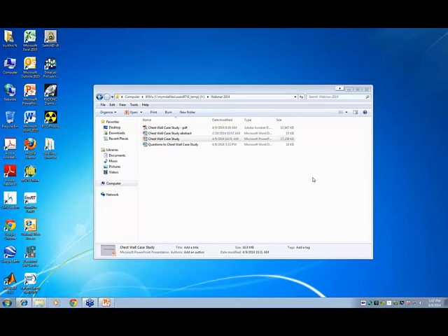The only one that we rule out is the angle between the lateral electron field and the central electron field. That one, we don't want too much gap in between there, because the bigger the gap, the bigger the overlap, and that's where you get mainly the big hot spot when you have these electron fields. That's why we do a junction shift every week, 5 millimeter laterally, just to make sure that we cover all the cold spots and the hot spots.